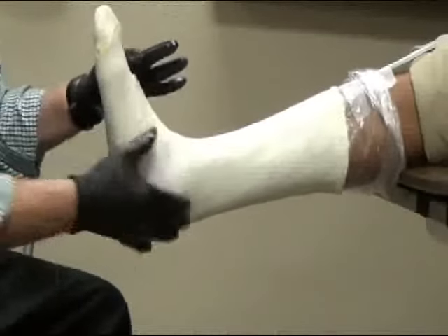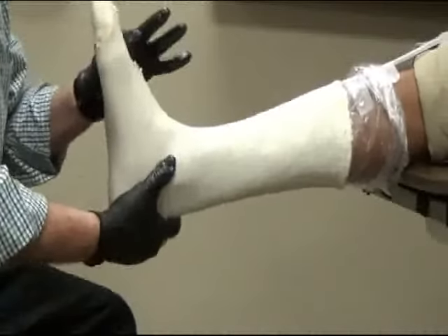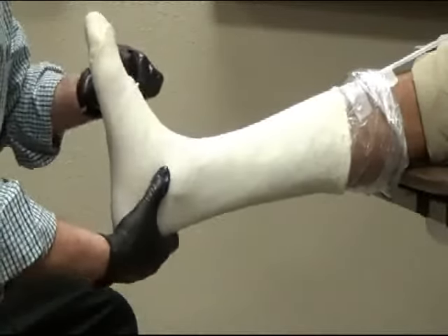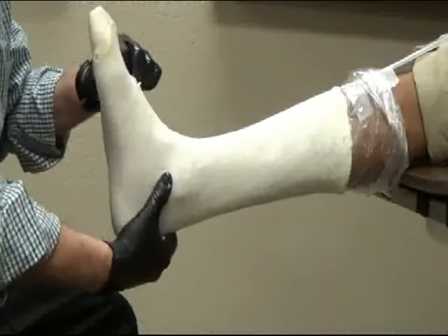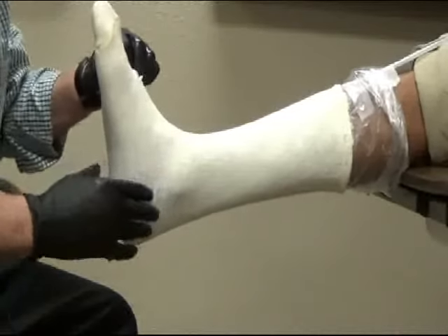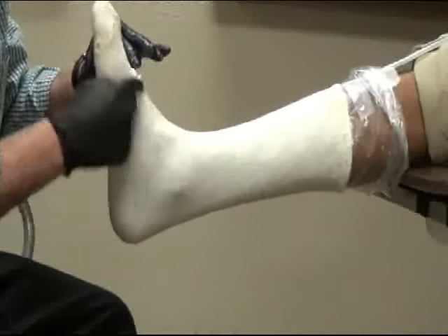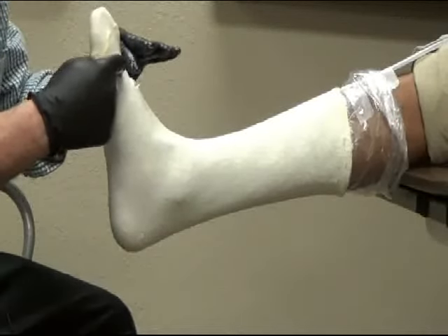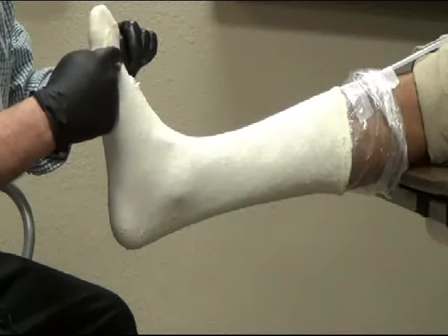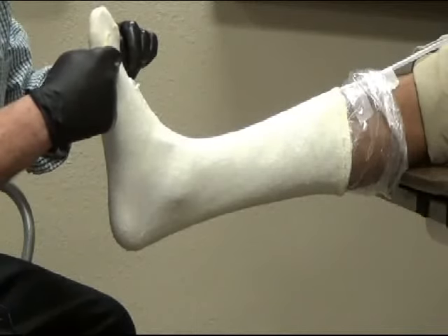Next, hold the foot in its proper position that you attempted before in the positioning part of this video. Make sure there's full contact of the STS sock with the arch of the foot. Make sure the neutral position of the subtalar joint is maintained, the foot is at right angles, and the first ray is in a fully plantar flexed position. Hold this position for about three to four minutes.